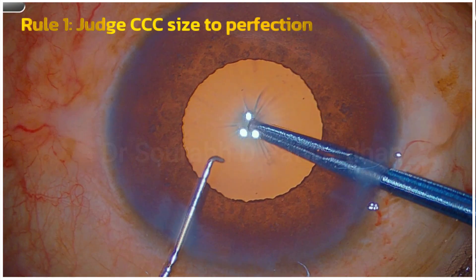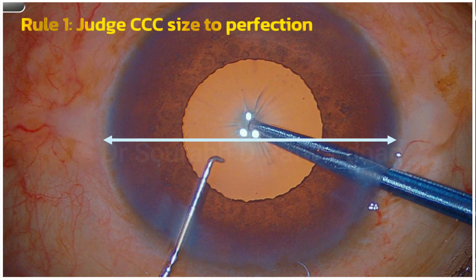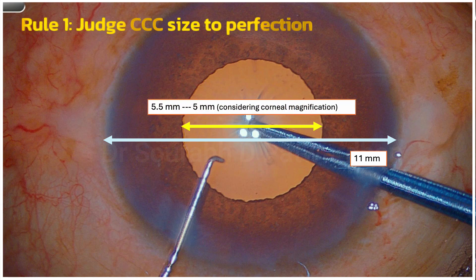The first rule is to judge the CCC size to perfection. How do we judge that without any devices? You can see that the corneal diameter is around 11 mm, and the pupil diameter is around half of that. Considering the corneal magnification factor of 12%, if I follow the pupillary margin I will get a rexis of around 5 mm, and that is something I should keep in mind while making the rexis.